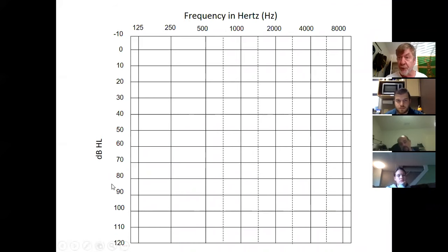The audiogram truly should be called the oddiogram, the weirdiogram, because the numbers increase going down, unlike any other graph in science. Oh no, ours has to go down. Great. There's a story behind that, but I won't go there right now. Anyway, this is how we do it in our field. The top means no hearing loss. The bottom means big hearing loss.